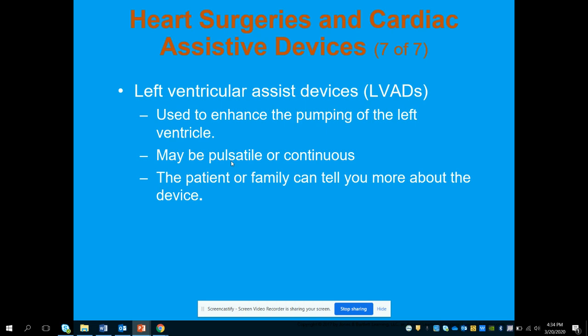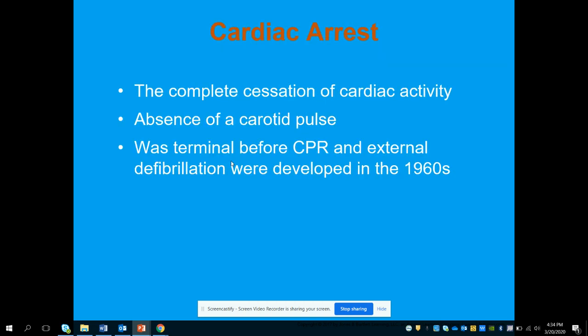and talking to you. So understand how that works, and you can look up some additional information regarding LVADs if you have other questions. But again, the caregiver will likely have all of the information for you, and that's really what you need to know: call the coordinator, take them back to the hospital where it was placed, and if it fails, we need to do compressions.